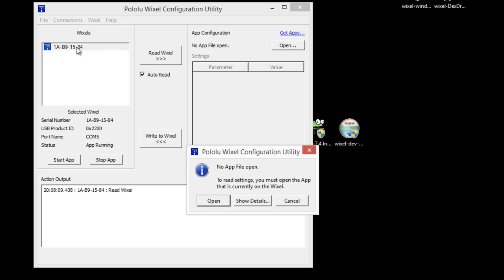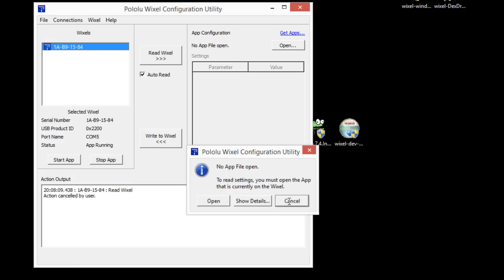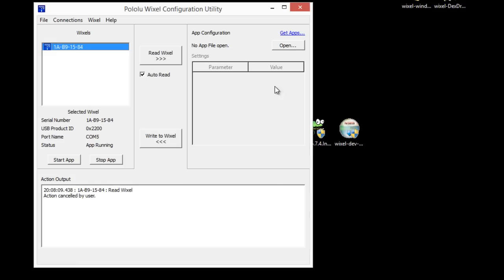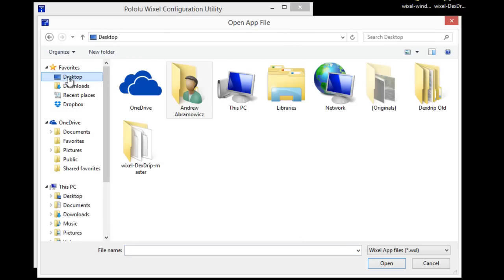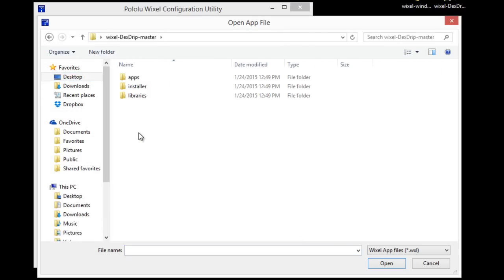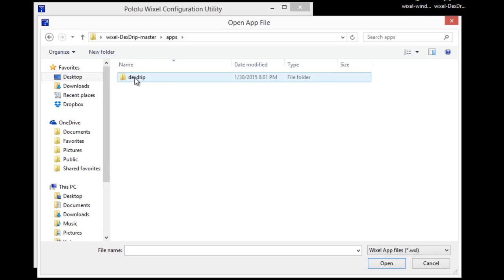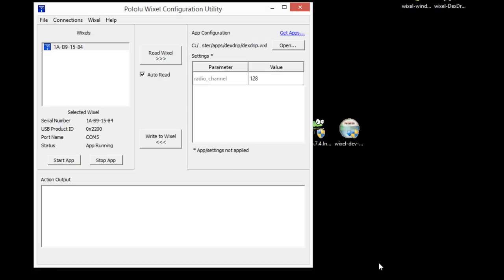If I click on it I'll get that error. So I'll just cancel that and go to open and get my app that I just built. So browse to the desktop, back to our apps folder, Dextrip and our software, and open that up.